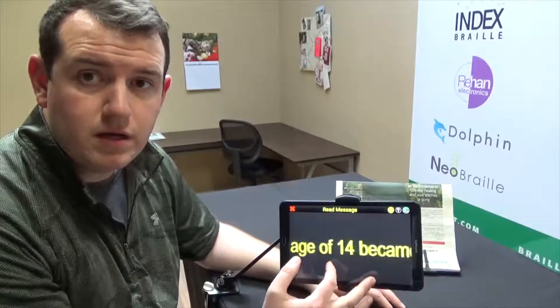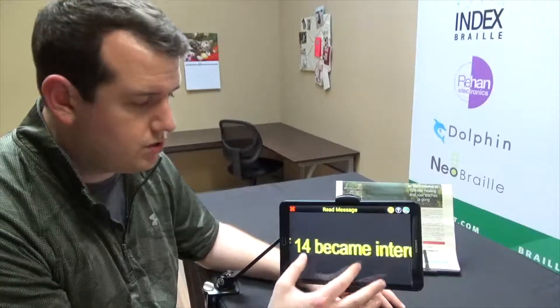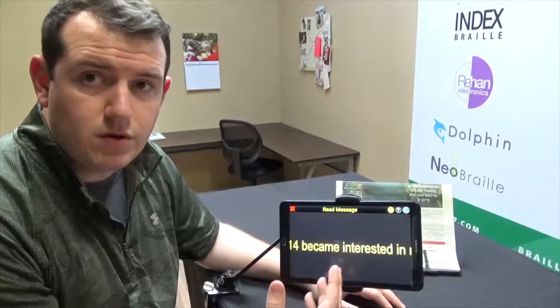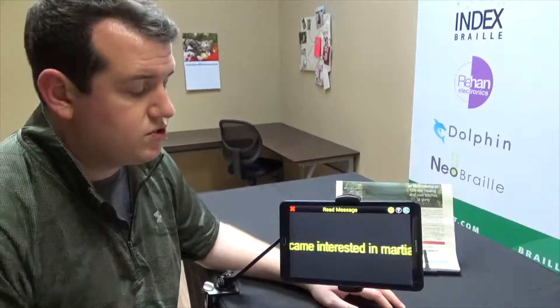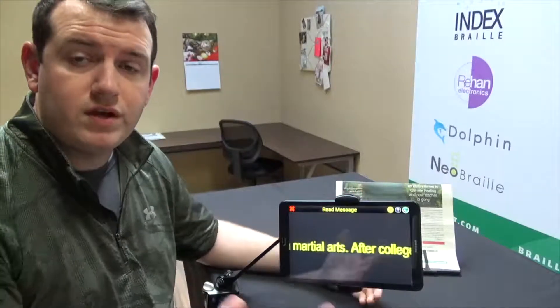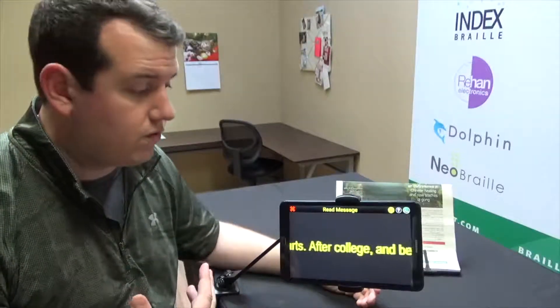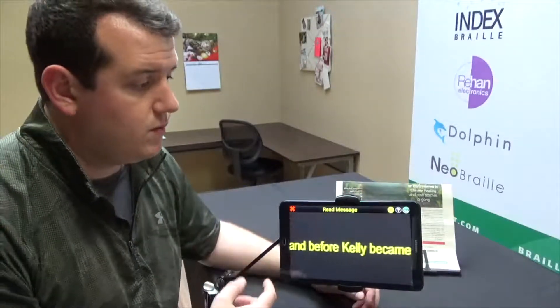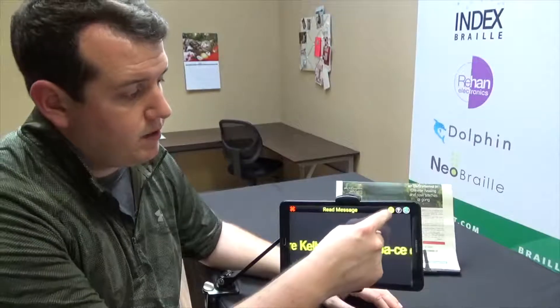You can pinch and zoom to make it bigger if you want it larger, or pinch and zoom down to make it smaller — whatever size you want. Then just swipe on the screen and it will scroll across, which is a nice way to read.